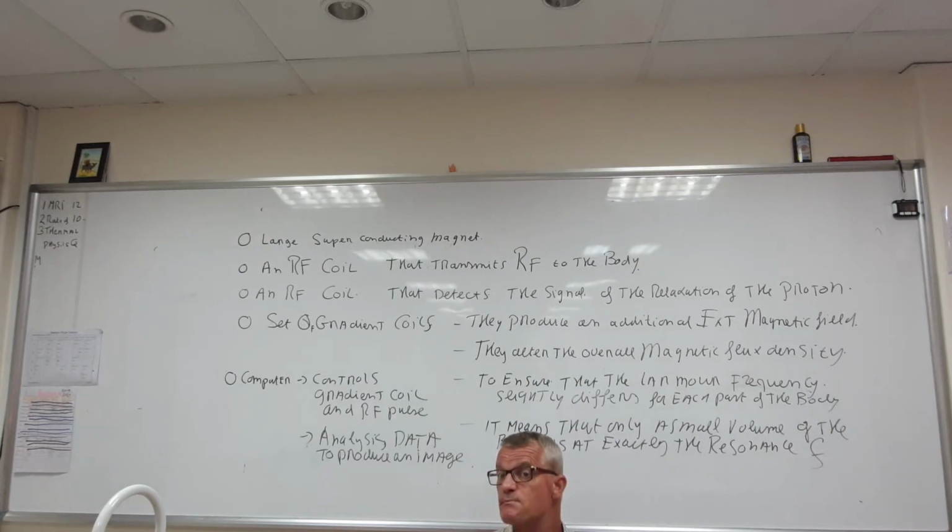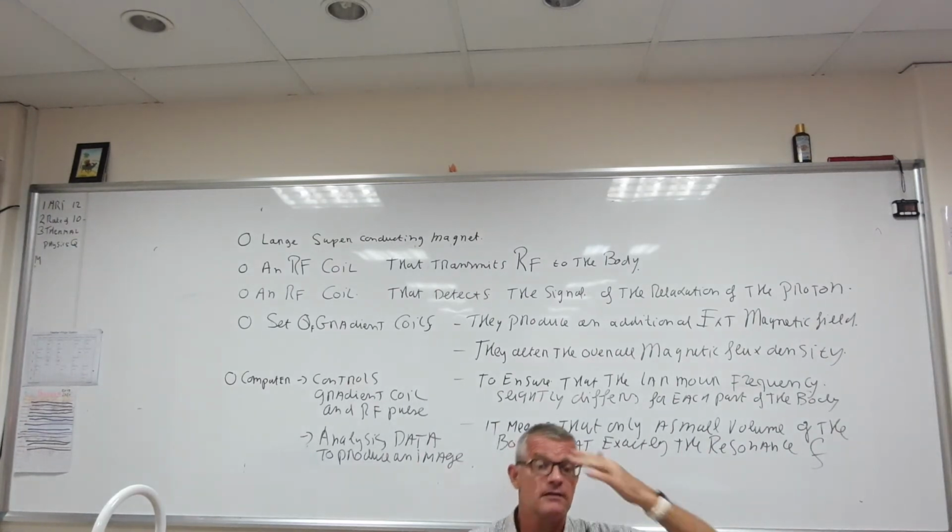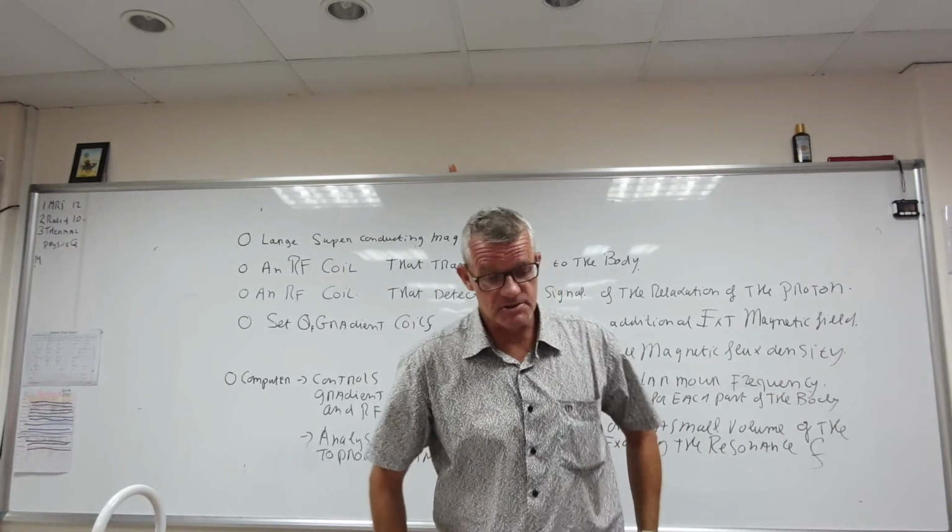So it's better that these patients don't use the MRI scanner. Another disadvantage is that you just have to be careful that there are no metal parts around, because we are dealing with a strong magnetic field. And maybe another disadvantage is that the MRI scanner makes quite a lot of noise.